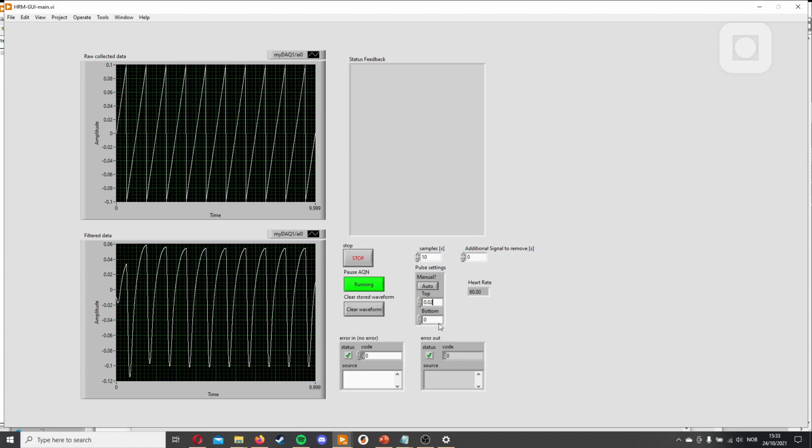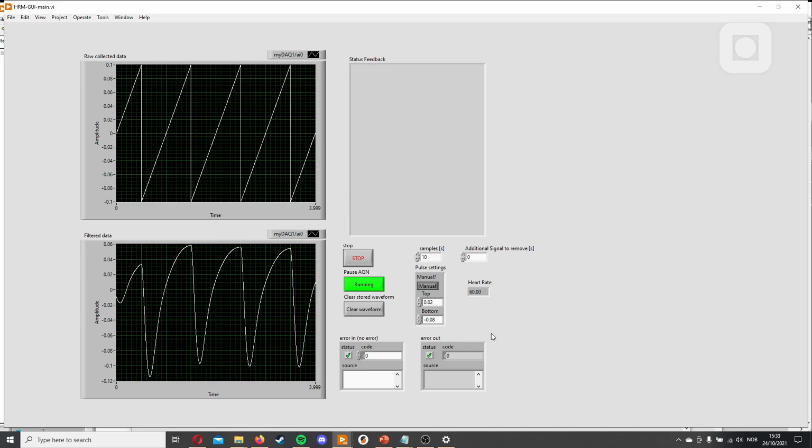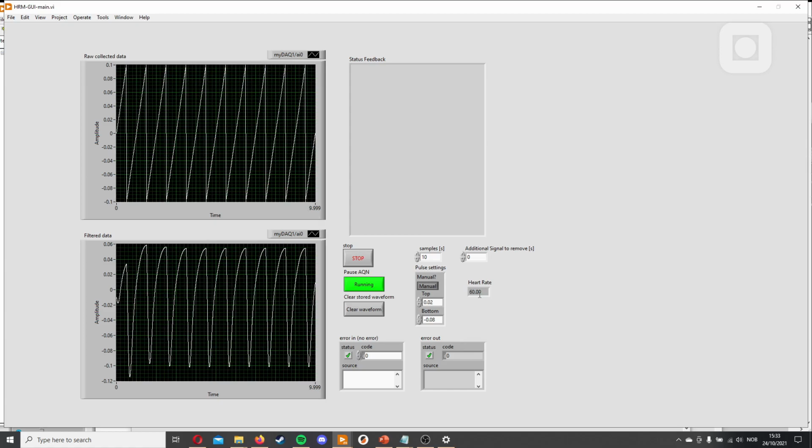0.02, minus 0.08. And then add manual, and we see it works, but we can't really see it, so let's clear the waveform to see that the new waveform comes in. And we see it stays at 1. It was even more accurate from the beginning because this is a slightly improved one.